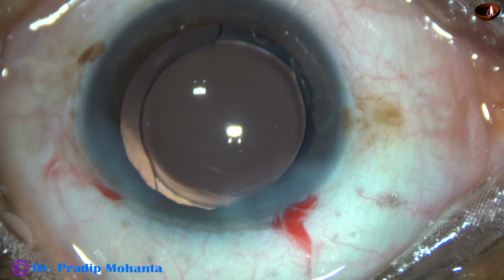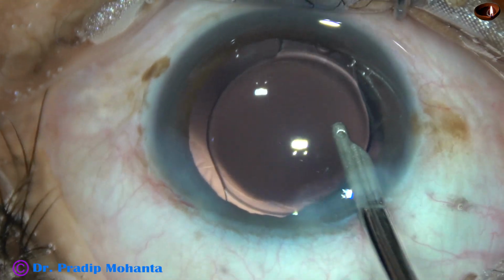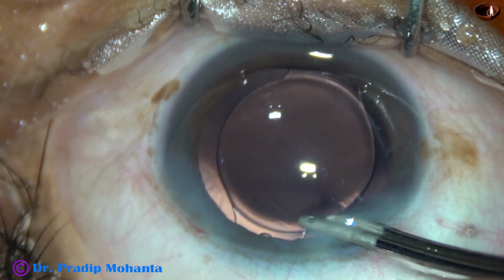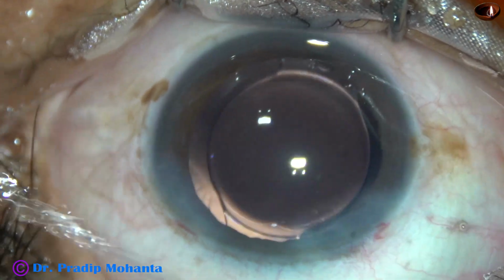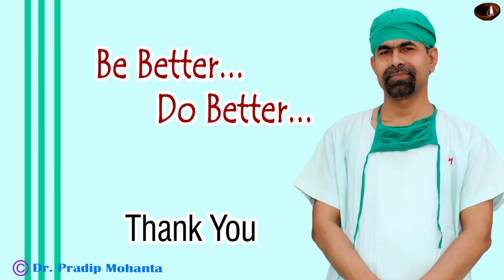And now our final lavage of the anterior chamber. At this time, whatever visco sticks to the corneal endothelium comes out. Any debris or anything comes out, but a lot of moxi molecules stay to control the infection.